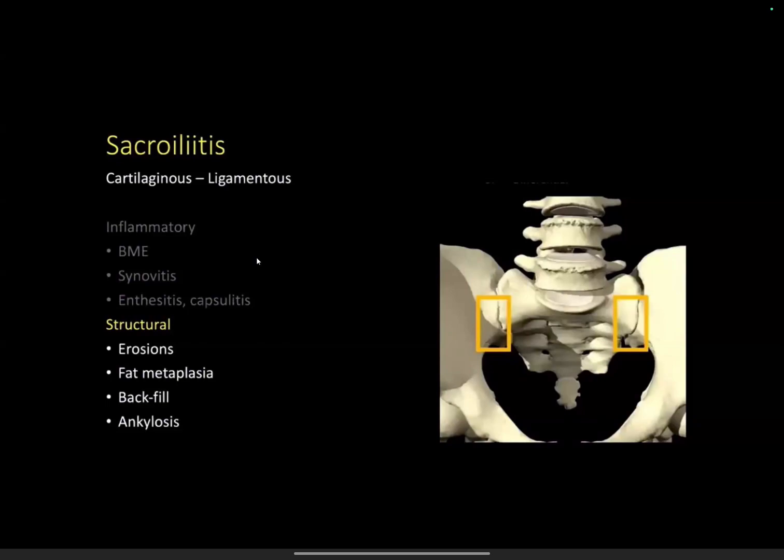What is the difference between syndesmophytes and bridging osteophytes? Syndesmophytes are generally seen in the spine, and bridging osteophytes would be in osteoarthritic changes. You would see subchondral sclerosis along the weight-bearing portion of the joint associated, right? So that differentiates it. Right.